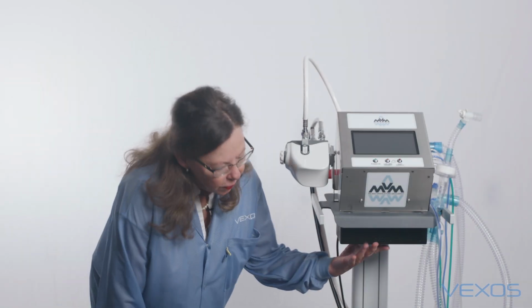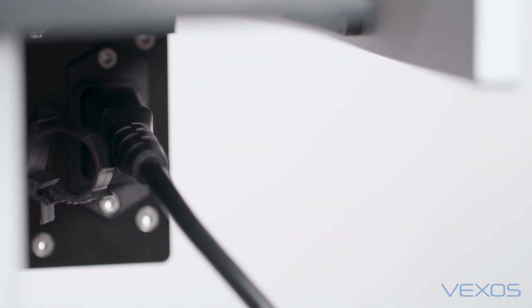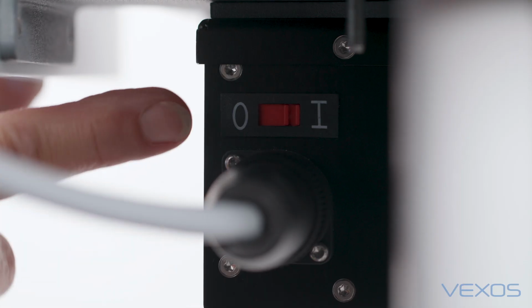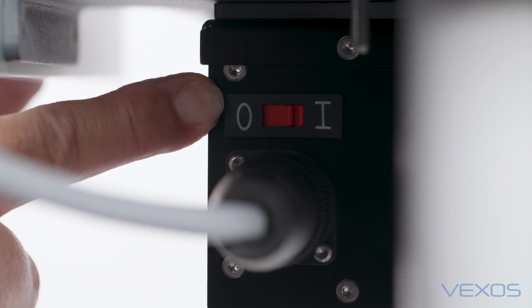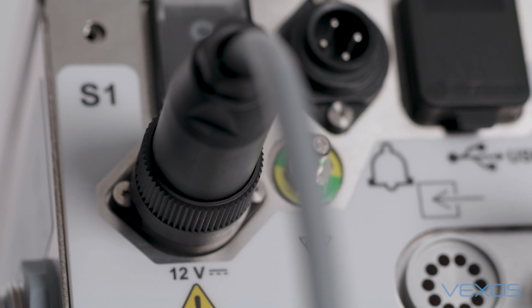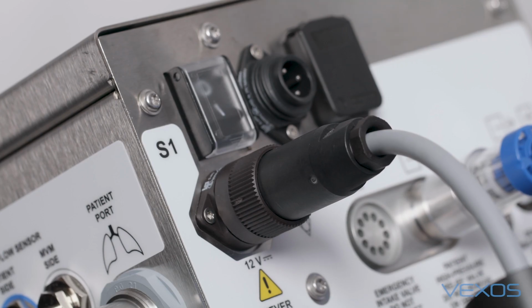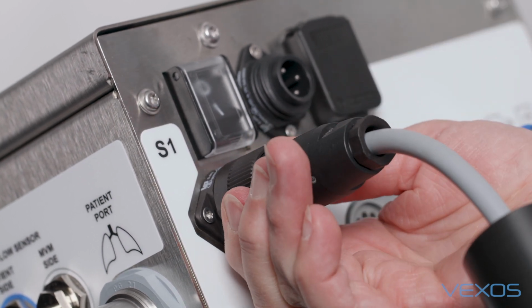Located underneath is the power battery pack. The outlet for plugging into the electrical source is located here and would be plugged into the institution's electrical power. On the power unit underneath the ventilator, there is an on-off or a 0 and 1 position for this switch. It should always be on in the 1 position. The short gray tube is attached from the power unit to the ventilator at this point here. The cable from the battery pack is fit into the MVM unit, and it's secured in and locked in.